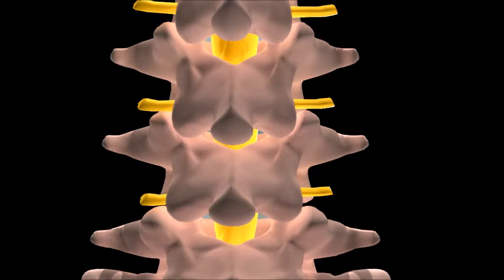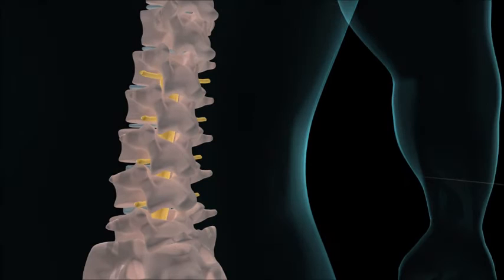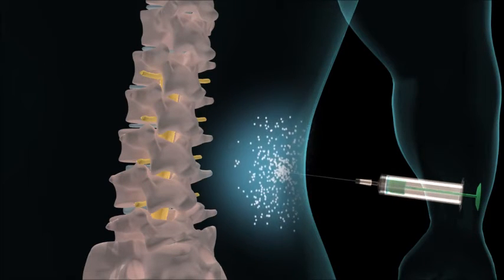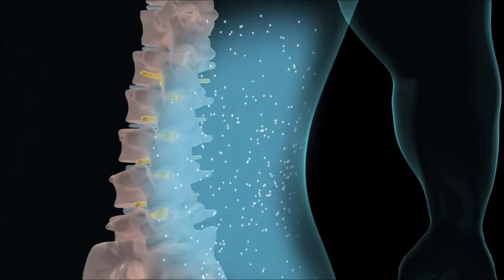The procedure is done under local anaesthetic. Dr Krishna will initially numb the skin and deeper tissues with a numbing medicine.